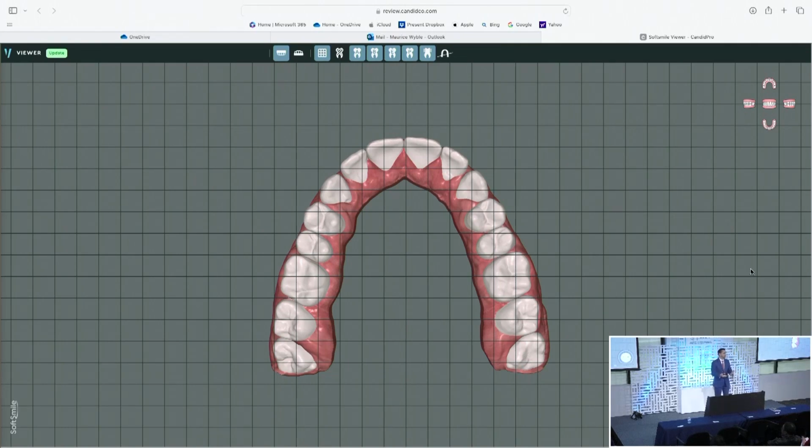So you just got to see what can happen at a college age where, hey, all of a sudden you get a tiny hiccup in the middle. Her top wisdom teeth are popping in. That's not a problem. Take a new scan, reset, and go after more width. That case begins at 31. We'll finish around 39 when we're done.